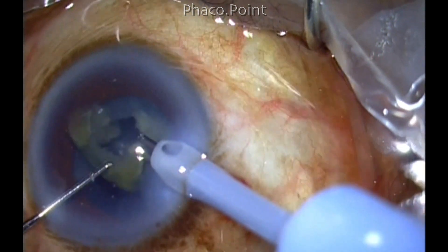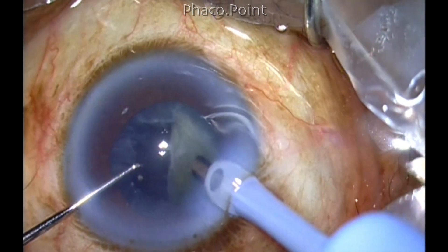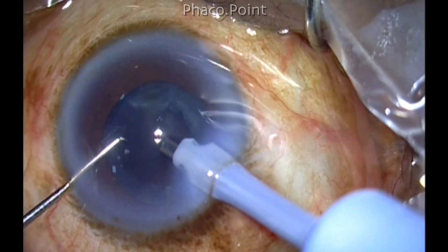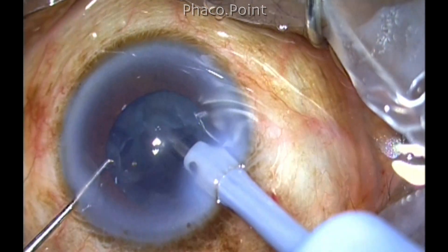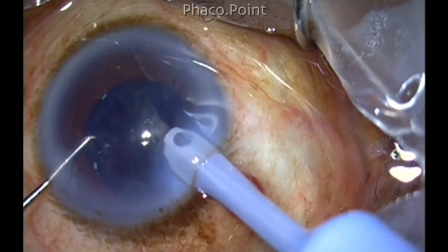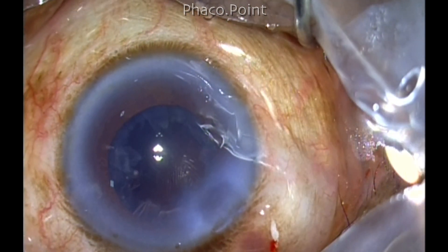Gentle phaco emulsification is done. The probe is always kept in the center of the eye. None of the instruments stray to the periphery — they stay within the central 4 to 4.5 millimeters within the capsular rhexis edge. The impaling of the pieces and the small size fragments can easily be mobilized through this size of capsular rhexis. The epinucleus is also removed with the phaco probe itself — just use vacuum; make sure you don't use phaco power. With just a little amount of vacuum you can attract the epinucleus and remove all of it from within the capsular bag. This is the nucleus management completed through a sub-5 millimeter capsular rhexis.